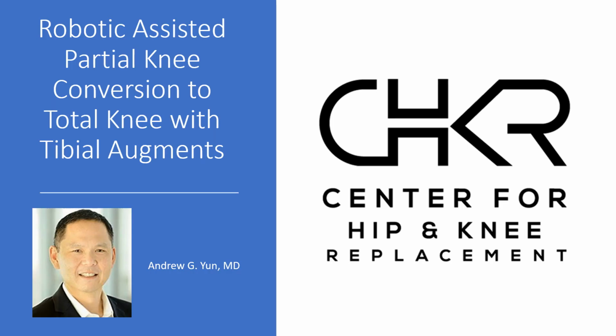So that was a brief case study on how we use technology, specifically CT scanning and 3D modeling, to get an idea 3-dimensionally of presence of hardware and whether it will impinge or not impinge, the placement of retained implants, possible bone defects, and then how we can compensate bone defects by adjusting the level of cut and then using metal augments to replace areas of bone deficiency. All these concepts were concepts that we used to use when we did conventional partial knee replacement conversions, but they're so much more precise when we're able to quantitatively and mathematically make these calculations using the power of data and computers.